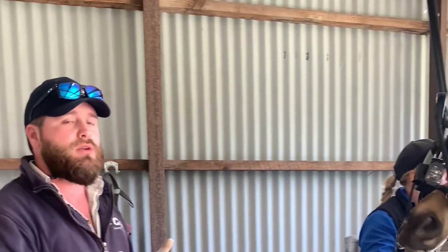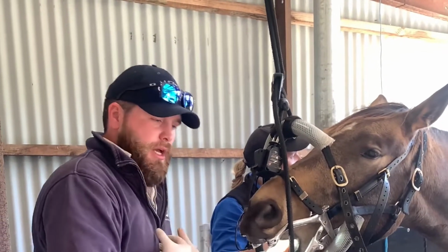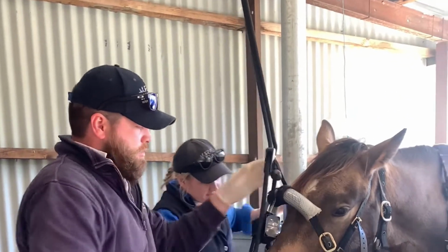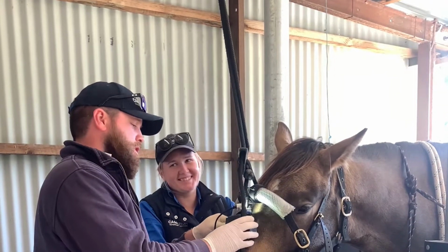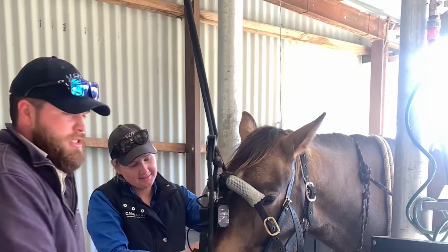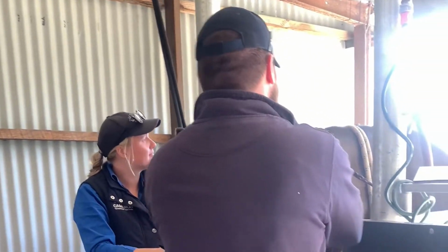They also give us the ability to look after many more horses in a day, economically on us and ergonomically on us, as well as on these guys. So there you go, guys. We've had a full thorough dental exam. We always have Nurse Lucy on side. She looks after these guys very well in the crush. So we maintain their stability inside the crush. We look after them and then we monitor them as they come out of the crush as well.